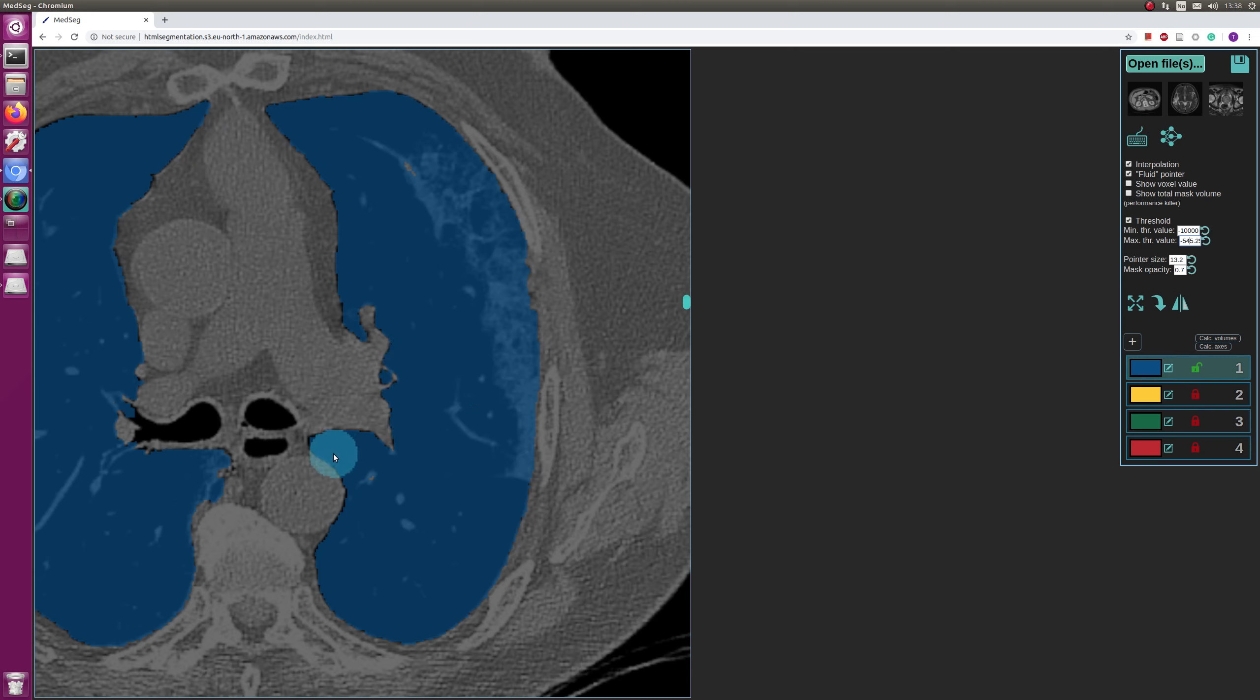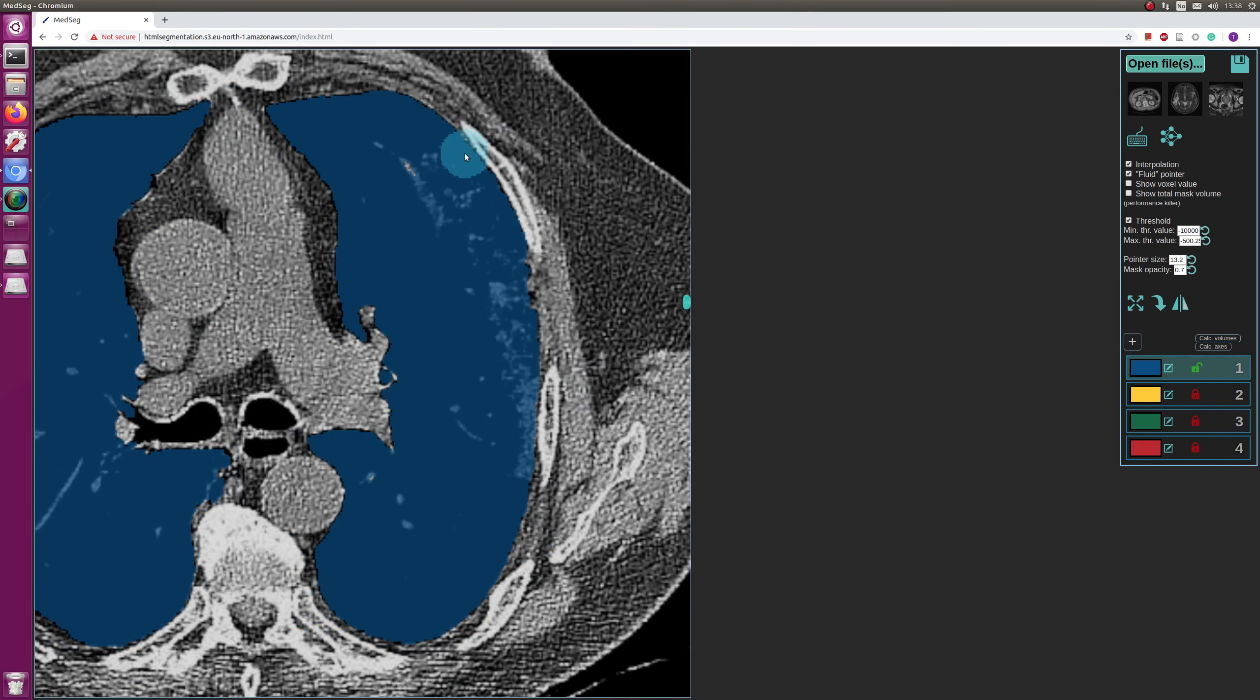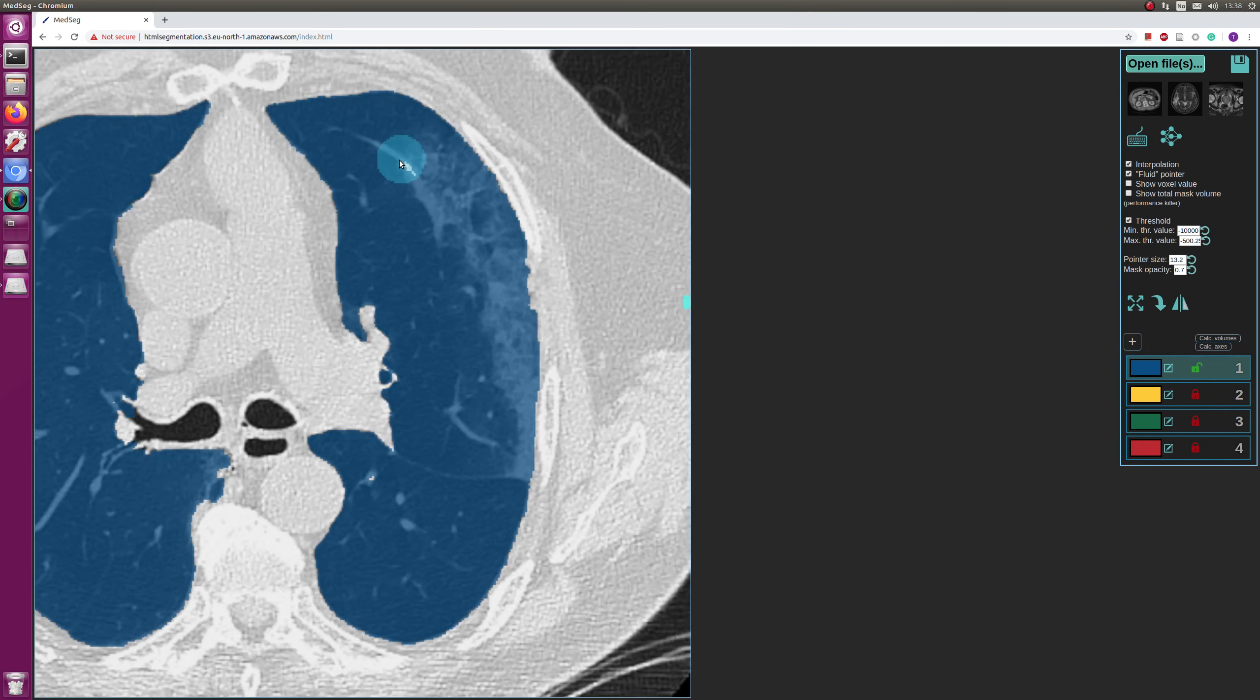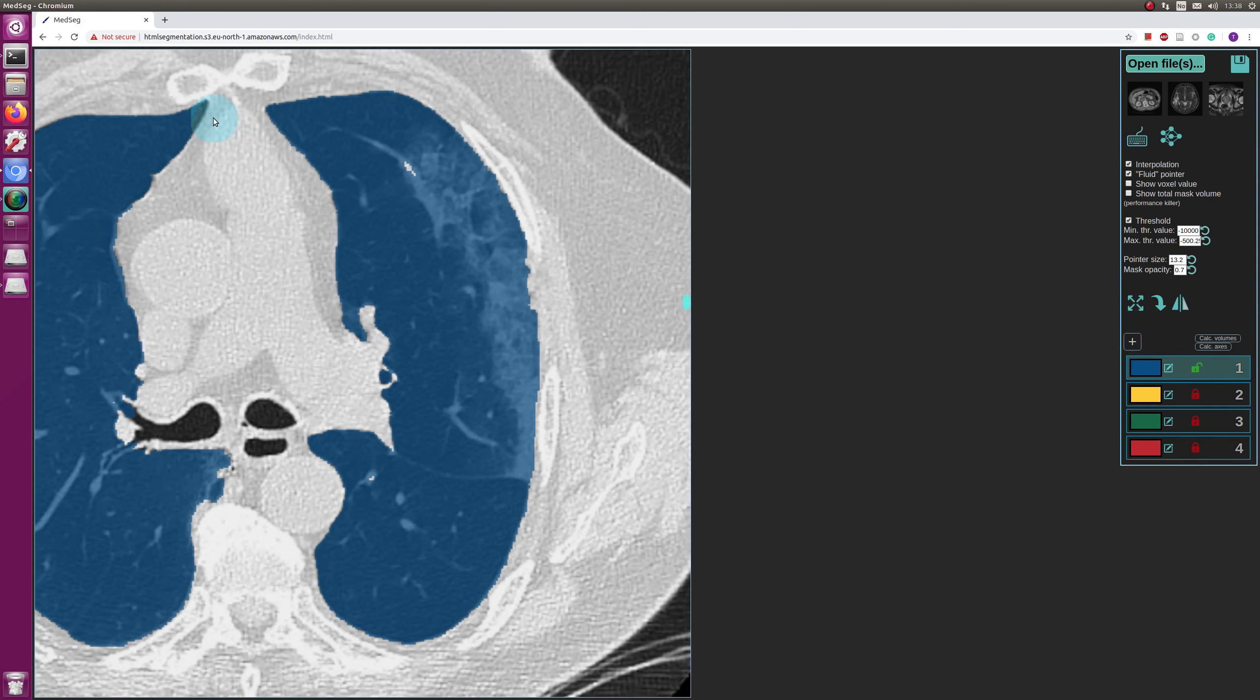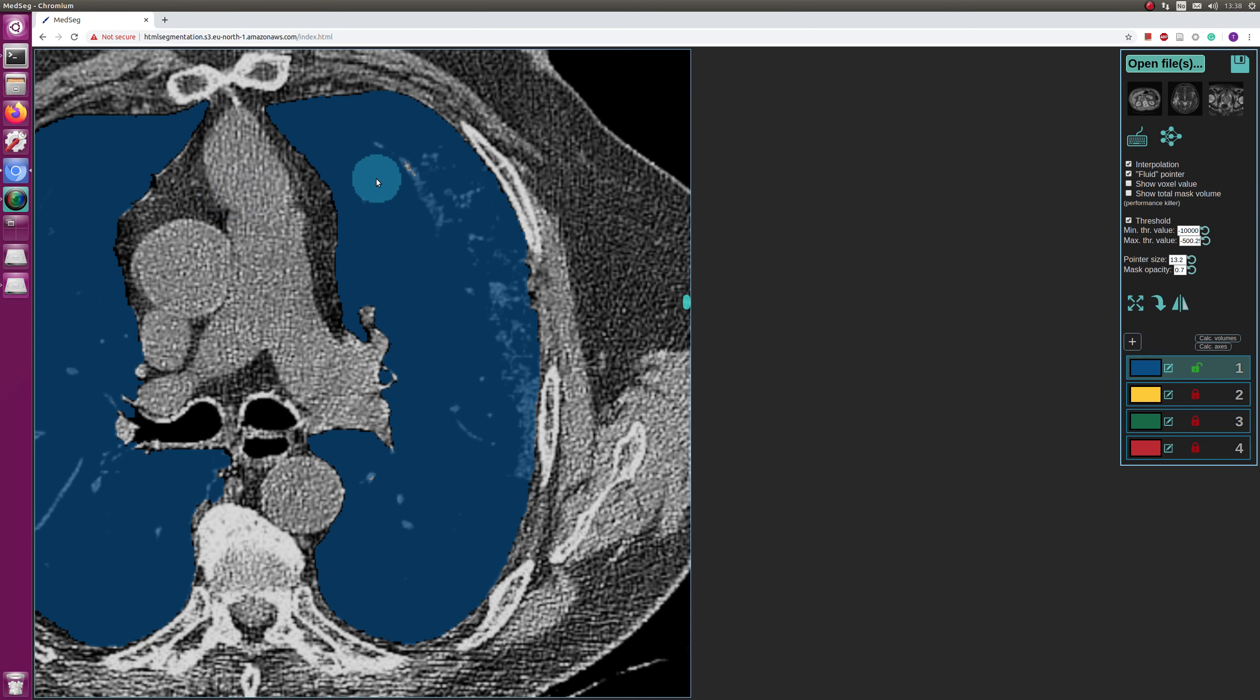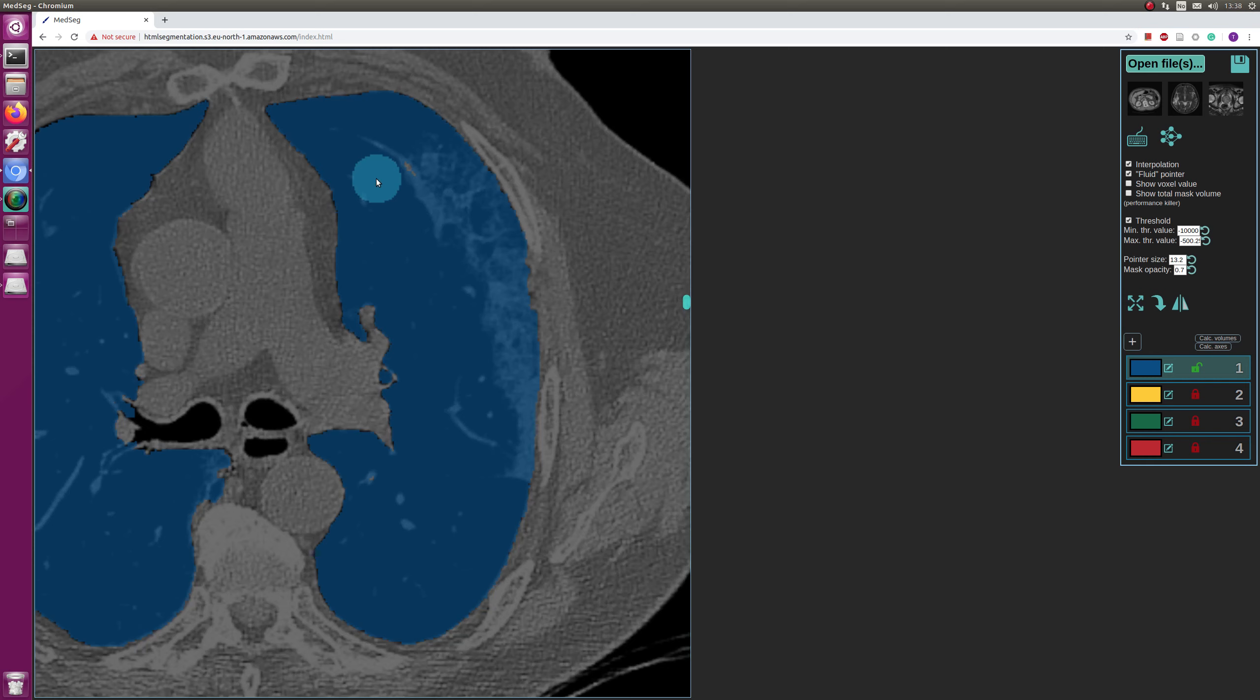And now you can see I can use that thresholding nicely to fill out a bit more, but actually I think it can be even a bit higher, so maybe minus 500. I think that looks okay. You see it looks a bit different depending on what windowing you have, but I think this might be a good windowing to have.